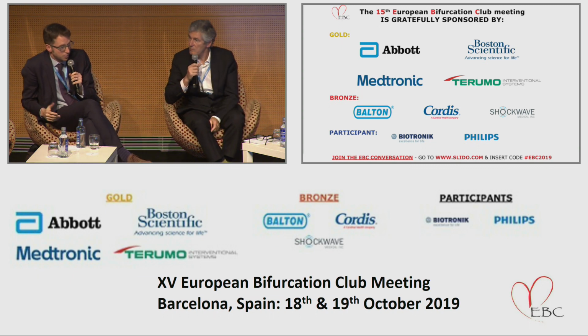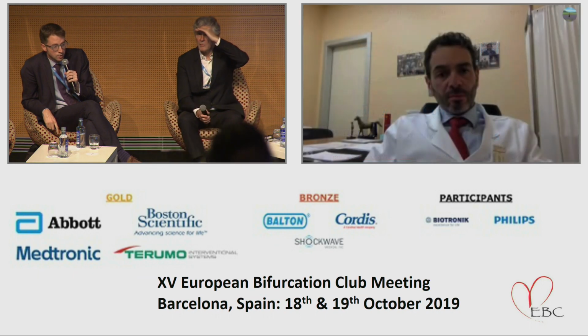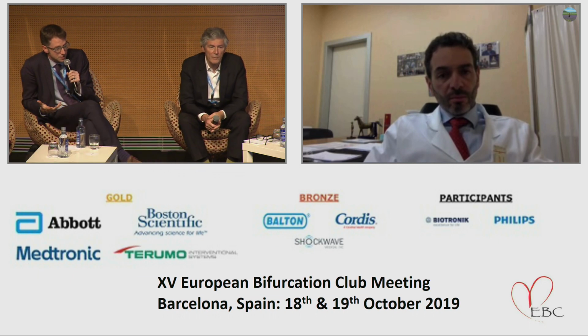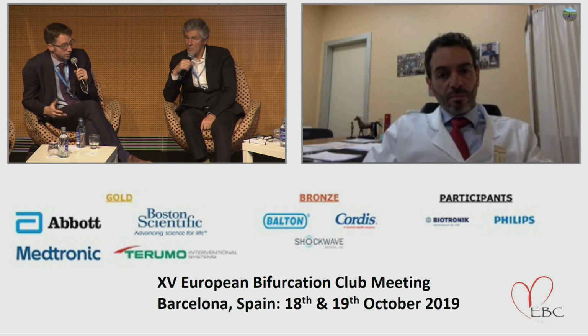Tom? I think it's a beautiful demonstration of how imaging has given us a better insight into the mode of failure. And then, Bernardo, your data is very exciting in the sense of showing the impact that an image-guided approach can have on reducing event rates. I think what's striking from all of the existing data, even in EXCEL, which we've touched upon, where image guidance wasn't mandated but was used to a certain degree, is that when we look at cases that have been image guided versus not, there always seems to be an advantage, without even an obvious protocol for how we use imaging. So just the badge of imaging seems to do something about giving us a better result.